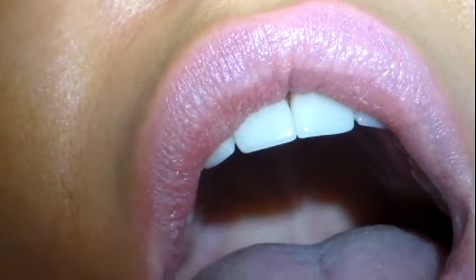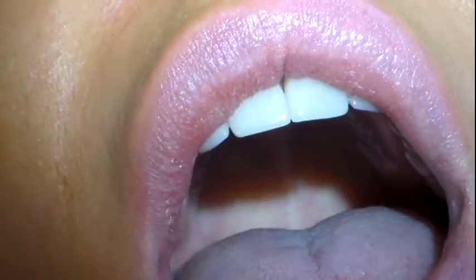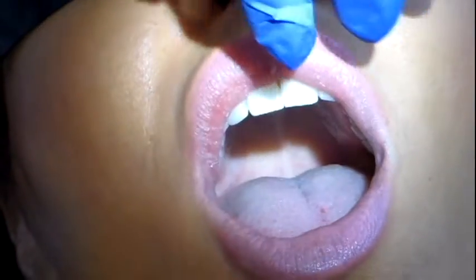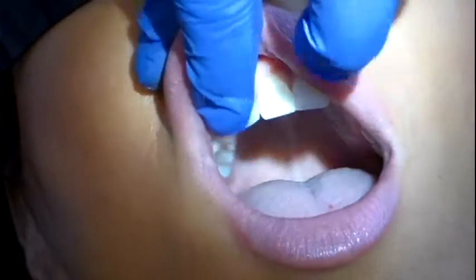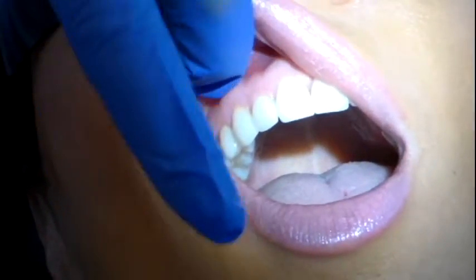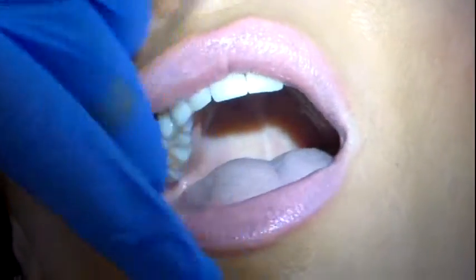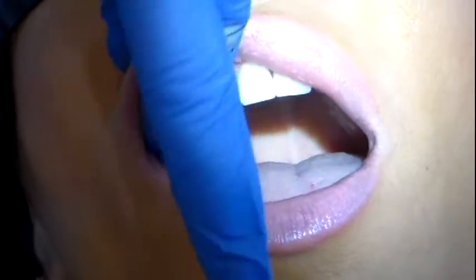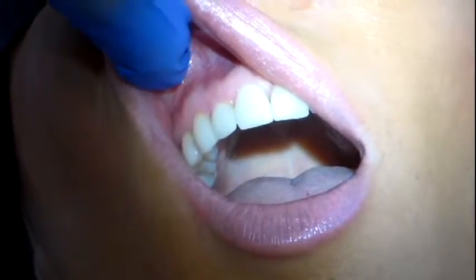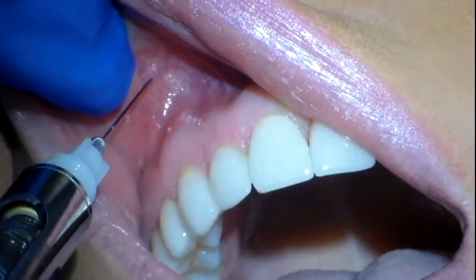Now I'm going to proceed with the injection. You have to match the slope of the alveolar bone and sometimes it helps to have a fulcrum. Sometimes I retract the lip with my pointer finger and my thumb and use my middle finger for a fulcrum, and sometimes it works better the other way — on her I think it's going to work better this way. When you retract you need to be just above the site. Don't be back over here, don't be right in the middle — go right to the site and go straight out. Now my finger's ready to catch the barrel. I caught the barrel.